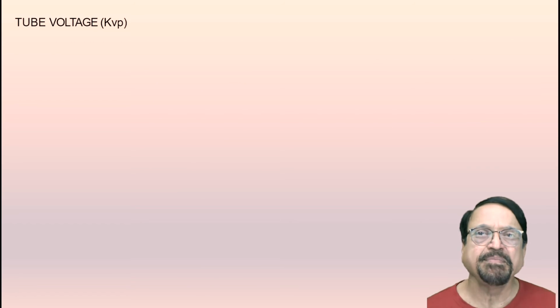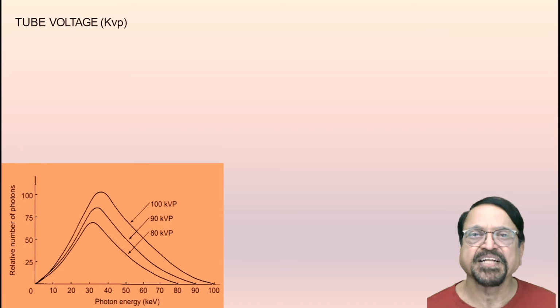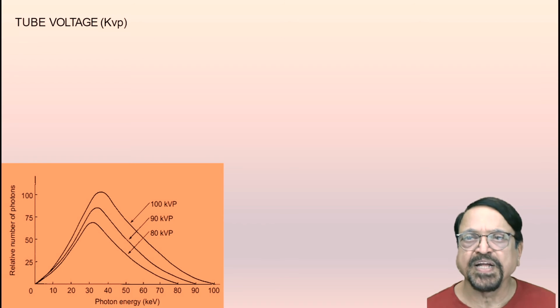Now, tube voltage, kVp. Again we are coming to some graphical presentations, showing photon energy versus relative number of photons.